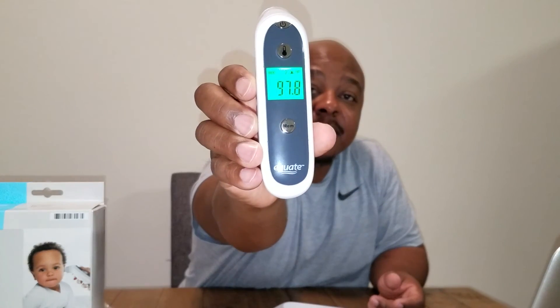Let me go ahead and check my temperature. Yeah, that's pretty quick. So I'm running at 97.8, and it said it was memory three.